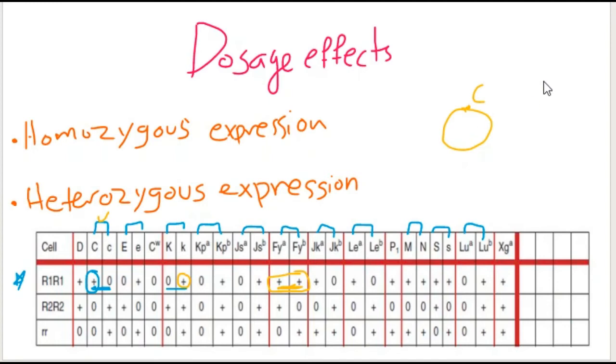So usually in red blood cells, we don't have only one copy of an antigen. We have thousands of these copies sometimes. So if it's homozygous, that means too much of that antigen is present on the cell. For example, here there is too much of big C on the cells. Here also the number of copies of small k is very high.